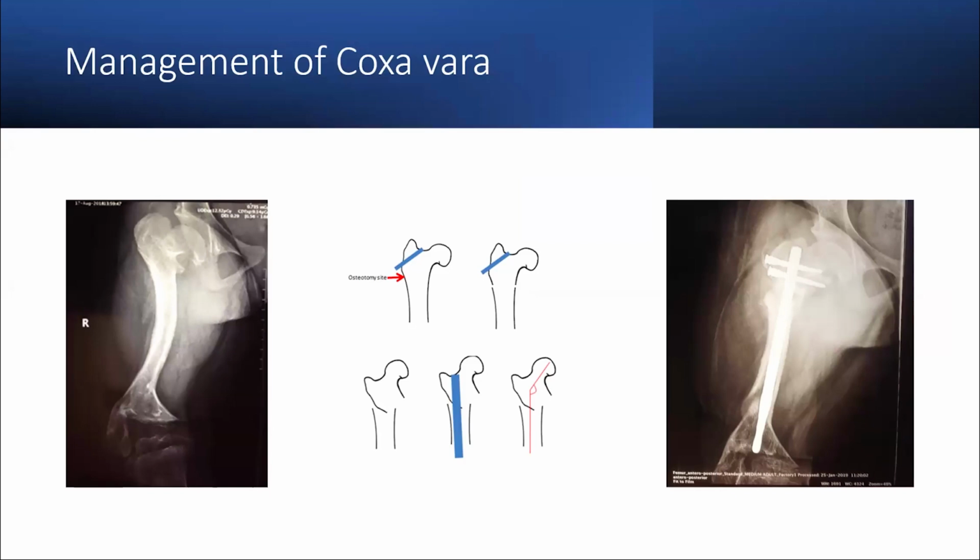You create a track for the nail, which would be the blue line there, and then identify the osteotomy location under direct vision, complete your bone section, reduce the distal fragment in relation to the proximal fragment, and then introduce your implant. In this case, we use the SIGN fin nail, which does not require intraoperative imaging. And then you get your outcome. So you restore the neck shaft angle.